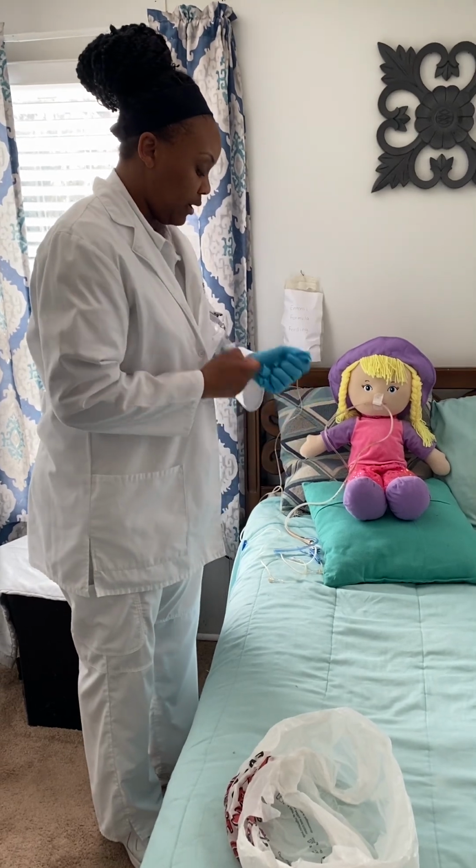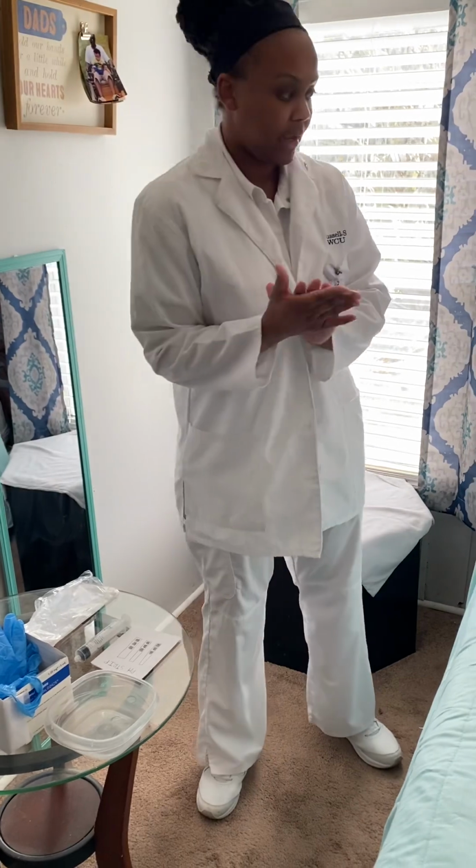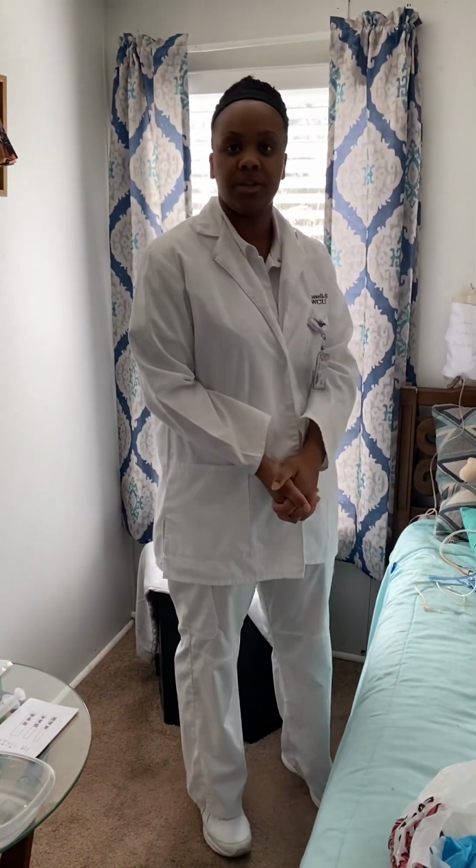I'm going to remove my gloves. I'm going to wash my hands, and then I'm going to document the procedure. So I'll document it, how the patient tolerated the feeding, how much residual the patient had.